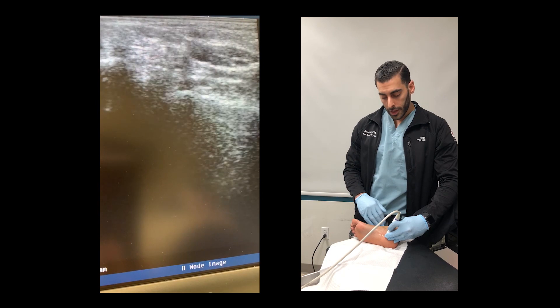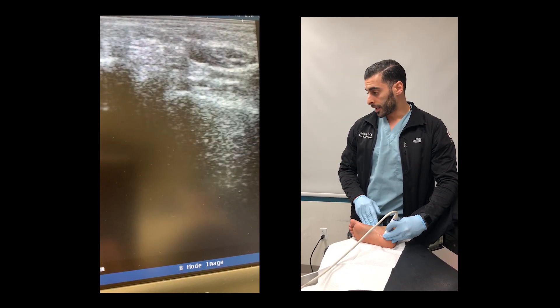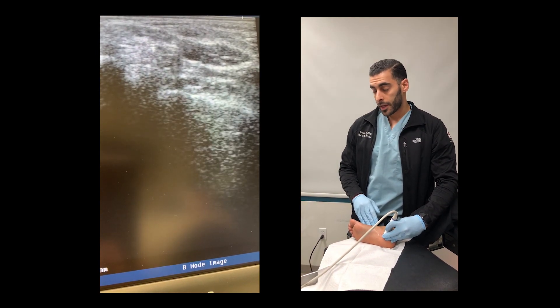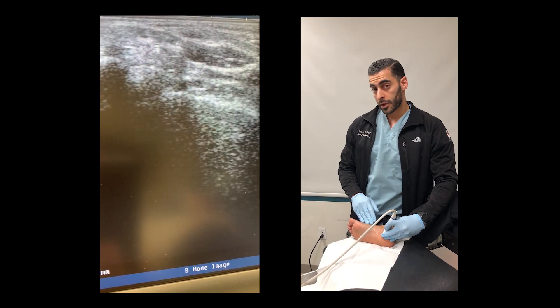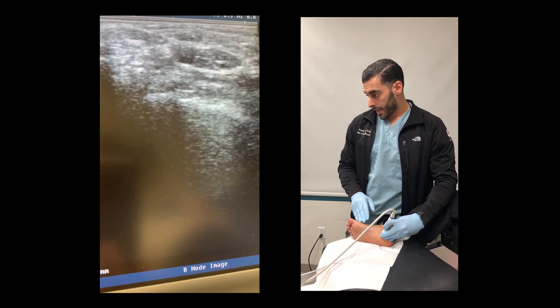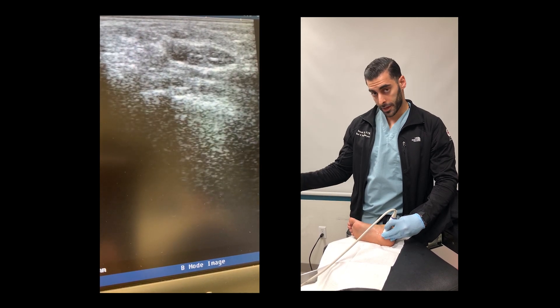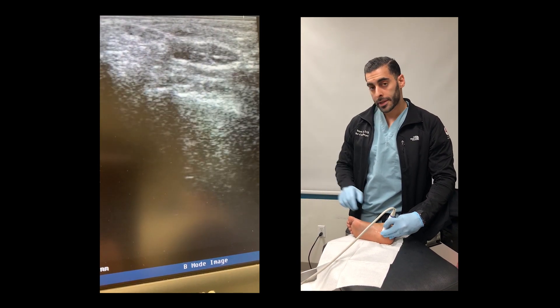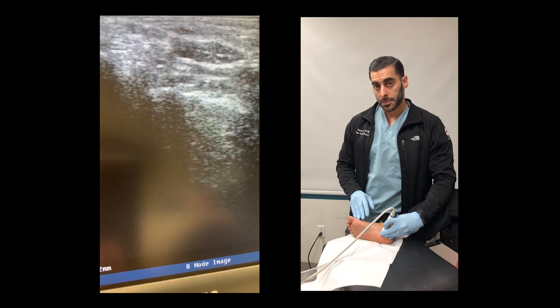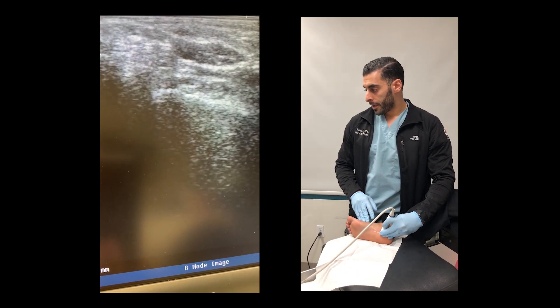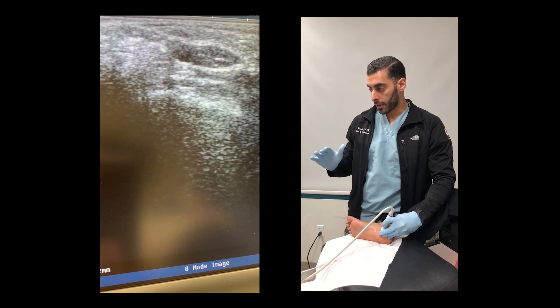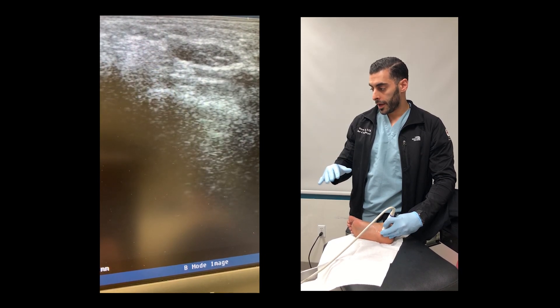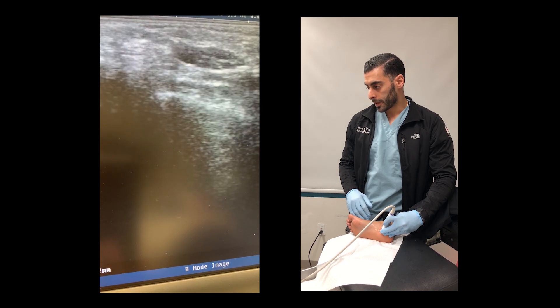I have the probe in the axial view spanning the tibia to the calcaneus, and right there you can see hugging the tibia is the posterior tibial tendon. You can also see the flexor hallucis longus as well as the flexor digitorum longus, and you can even see a pulsating vessel there — that is your posterior tibial artery. The honeycomb appearance nearby is the tibial nerve, and encapsulating all of those is the flexor retinaculum, a ligamentous structure that encapsulates all of those structures.